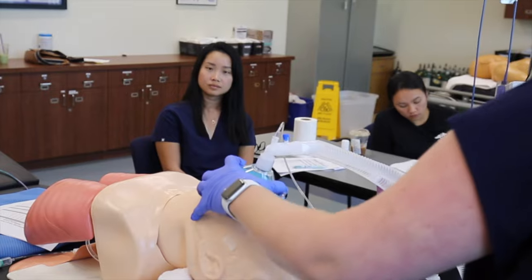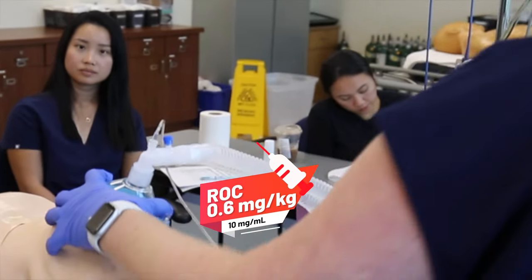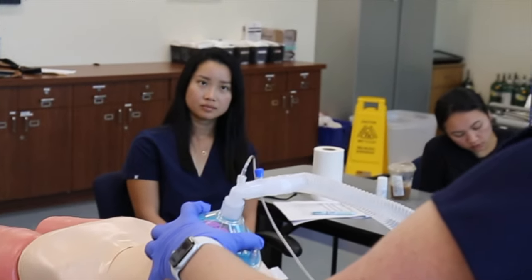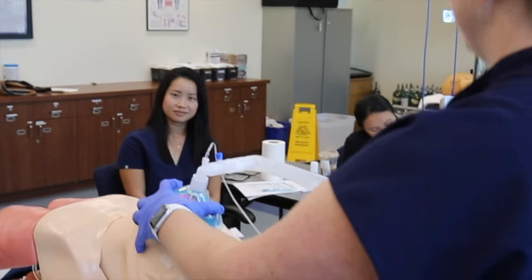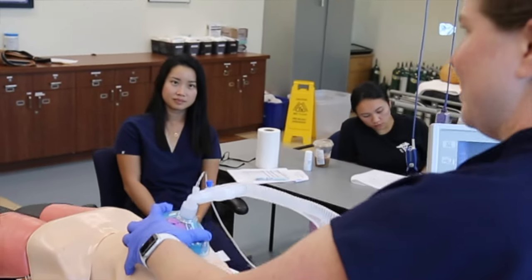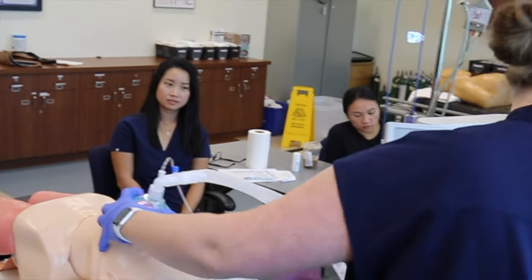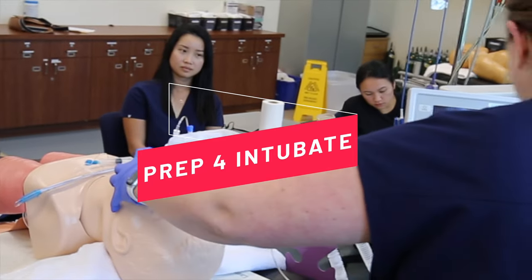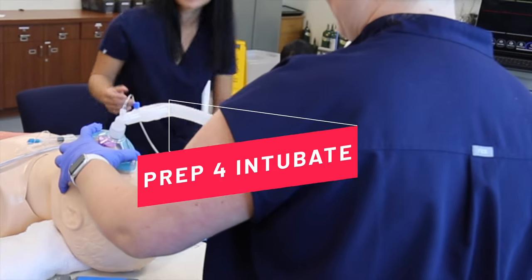So I've established that I can ventilate. Now I'm going to push my paralytic. 60 milligrams of Rocuronium. Turn this up a little bit. And this is it. We're just hanging out here and we're ventilating. And as the paralytic sets in, you're going to feel like, oh, it's easier to bag. This is good. I'm happy. While this is happening, I'm going to bring my intubating equipment over. Do you mind assisting me for intubation?